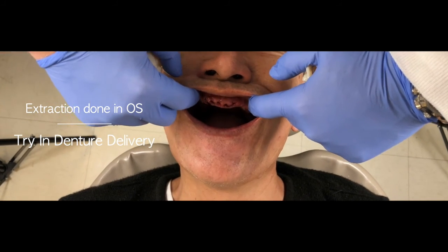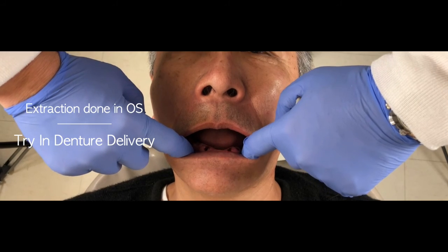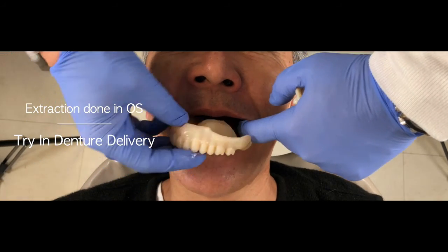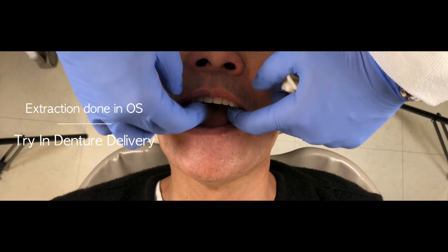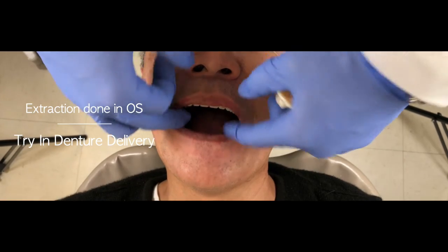In the case of maxillary and mandibular both-arch immediate case, patient got maxillary and mandibular teeth removed, and we are going to deliver maxillary and mandibular try-in denture after teeth extraction.